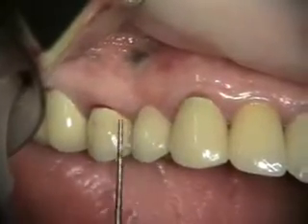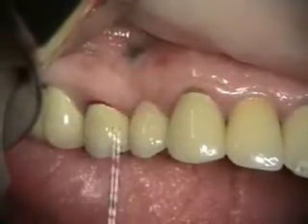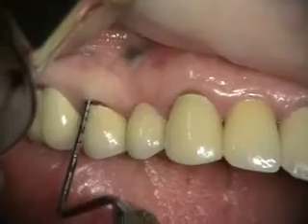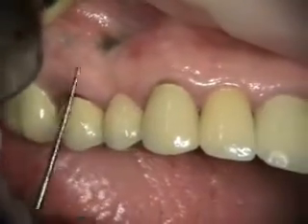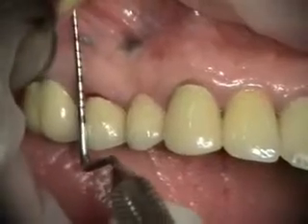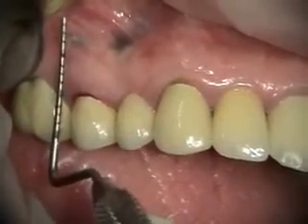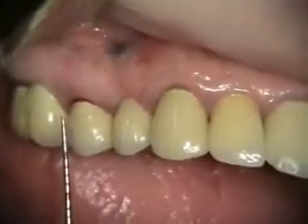That way she can have an aesthetic tooth and not have to transition with a stay plate. But because of the bone loss in this area, we're not going to be able to do an immediate implant. Looking at the x-ray, the apex of number four is pretty much right at the base of the sinus, whereas there's a lot more bone height in the number five site.